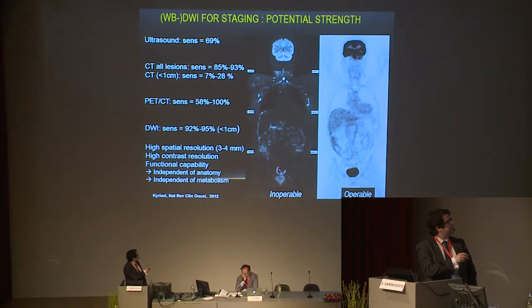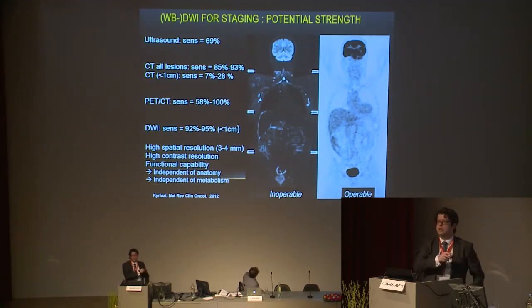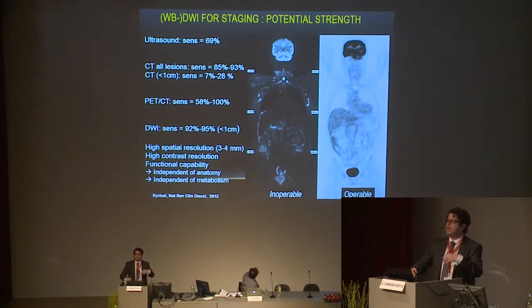Also here you can see the sigmoid. This is the confluent tumor on the mesosigmoid, and here the tumor is protruding to the wall of the sigmoid. And this is the major advantage that it has. Diffusion MRI is quite difficult to learn, but can go quite fast. We have some physiological activity that we have to recognize.